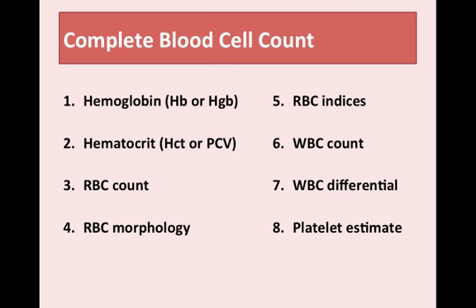In our discussion today, we are going to focus on hemoglobin, hematocrit, red blood cell morphology, and red blood cell indices. So let's take a look at some of these tests.